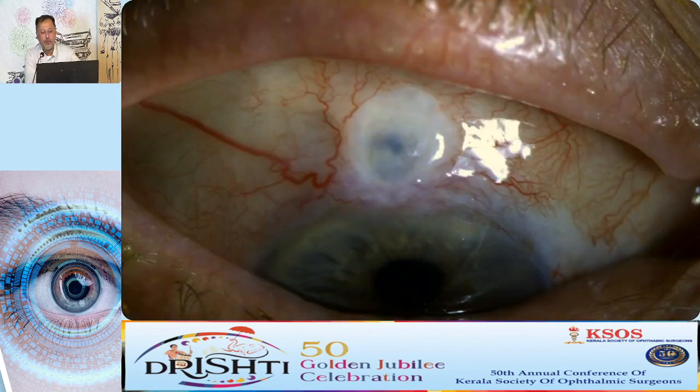So here is someone who has had a cataract operation some time ago. This was a very avascular sort of bleb. We did give her some mitomycin and we did break the edge where the ring of steel was. Despite that, it remained avascular and horrible looking, but that bleb is still functional and the pressure is quite reasonable.